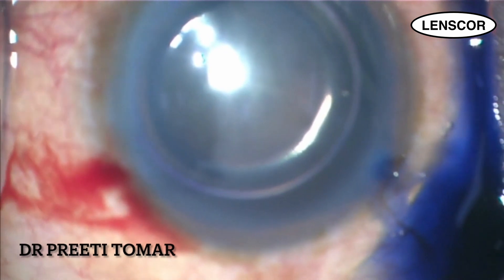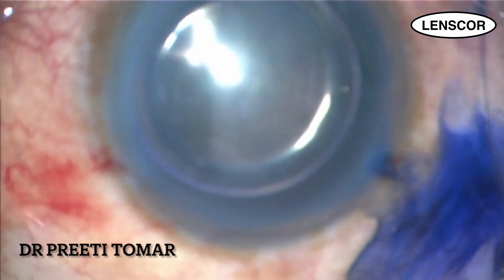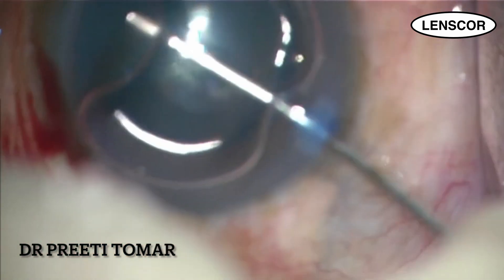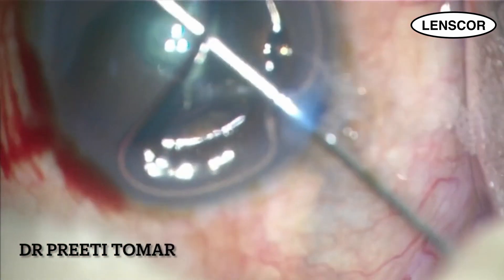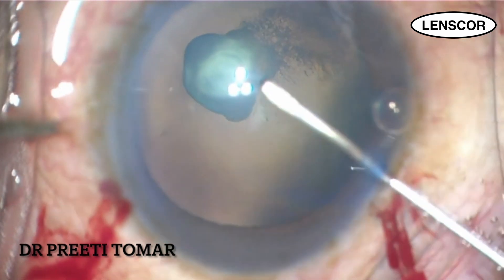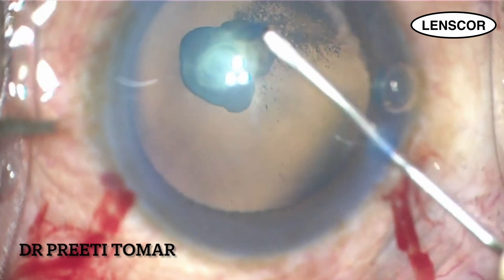The important point to remember while filling the anterior chamber with viscodispersive OVD is to keep the anterior chamber underfilled in a case of posterior polar cataract, so that the pressure in the eye does not rise and the eye remains soft.